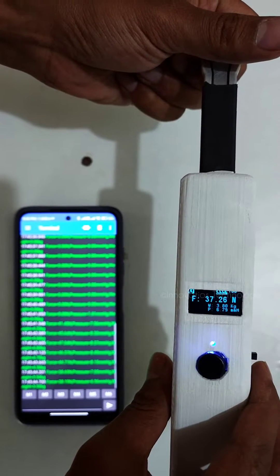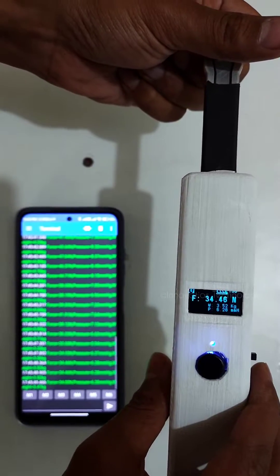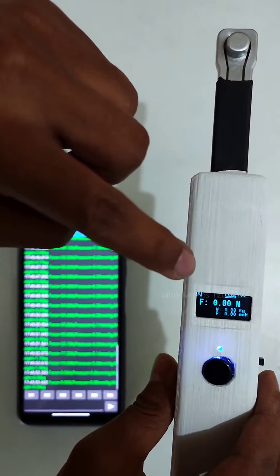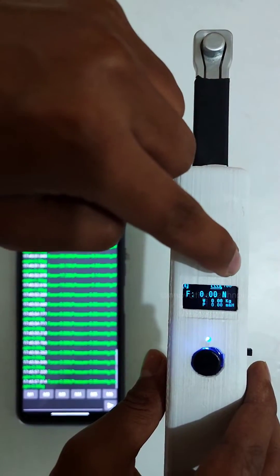Force is displayed in Newtons, weight in kg, and pressure in mmHg. There are also a few indicators: the top left corner shows when Bluetooth is connected, and the top right shows battery status.